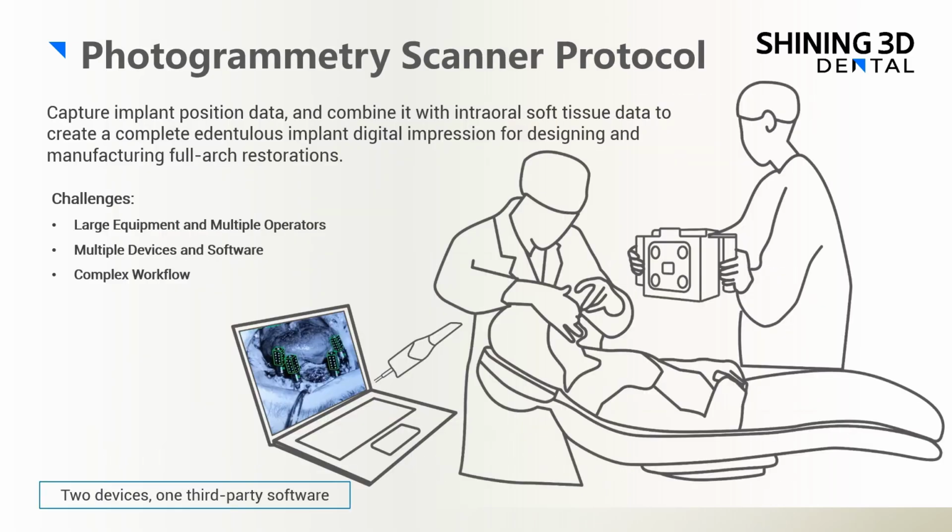The third workflow we introduce in this part is the photogrammetry scanner workflow. By photogrammetry scanner workflow, we mean workflows using an extraoral photogrammetry system. An extraoral photogrammetry system is used to capture the positions of the implants. It is a fast and precise tool for measuring implant positions using photogrammetry technology. The extraoral photogrammetry system quickly records implant positions, achieving precise measurements even with uncontrollable factors such as patient head movements, but it also poses challenges for the user.